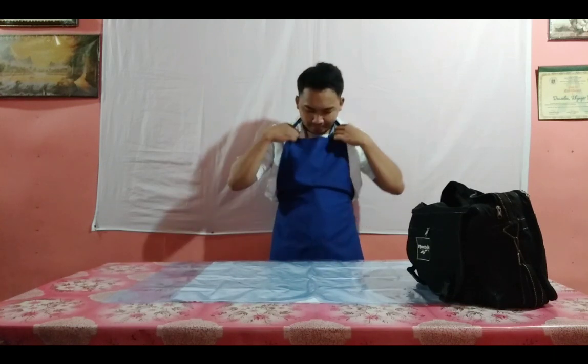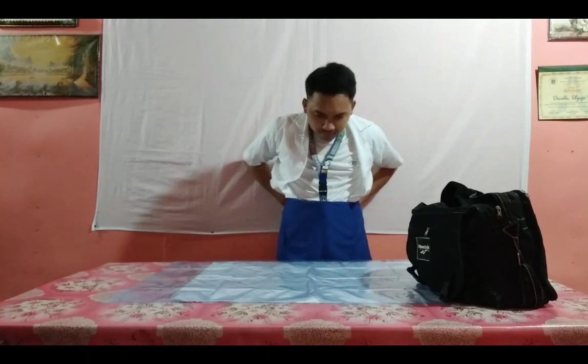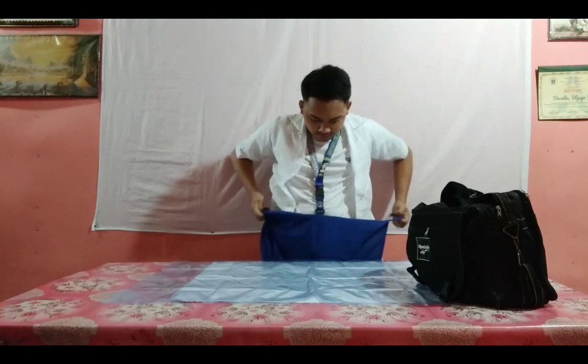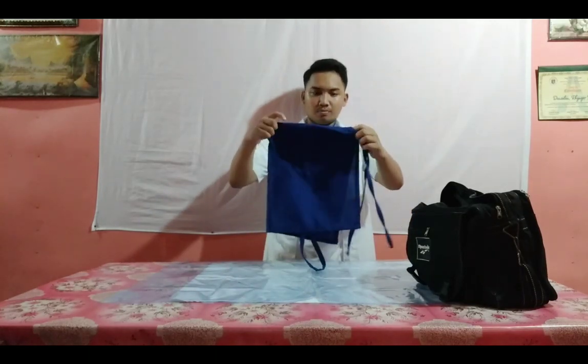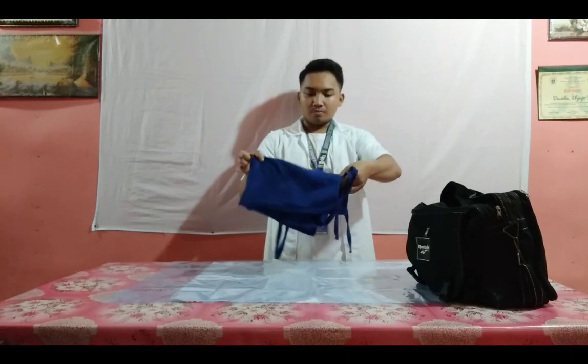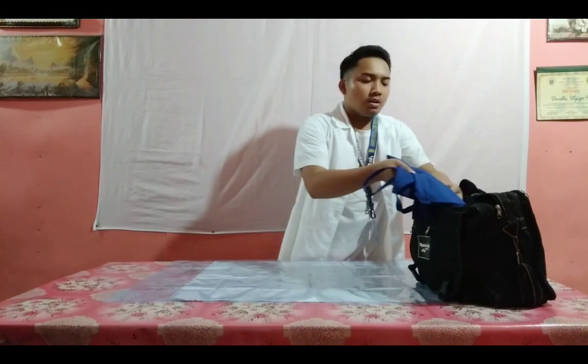Place over the flaps of the bag. Now fold the plastic lining, contaminated part in, and place over the flaps of the bag.